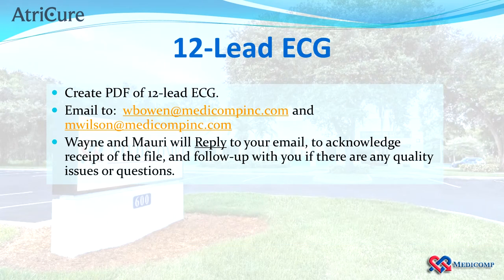Okay, so let's get started. As previously mentioned, our services include the adjudication management of 4 12-lead ECG tests that will be performed at visits 1 through 4. According to the trial guidelines, you will wait until all 4 tests have been completed and then email the set to us. We will take over from there. We require that you create a PDF file of each 12-lead and email them to Wayne and Maury at Medicomp. We will in turn reply to your email acknowledging receipt of the files and follow up with you if there are any quality issues or questions.